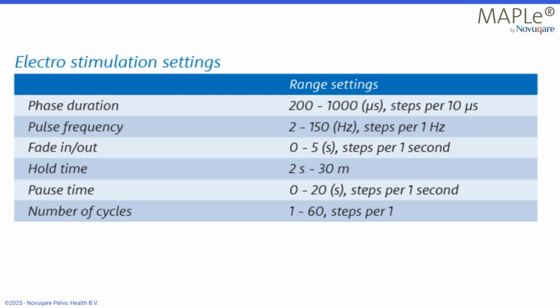The Maple system is used for performing measurements and applying electrostimulation. Electrostimulation is limited to a maximum of 29 milliamperes. Performances exceeding this limit pose risks, as identified during risk management. Overstimulation can lead to unacceptable risks.